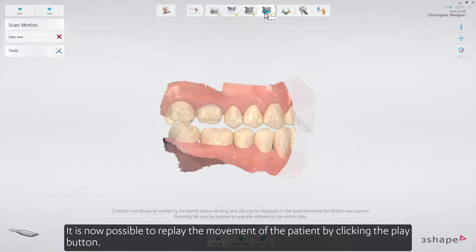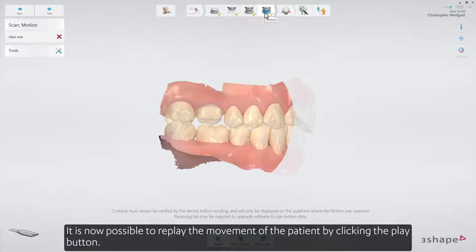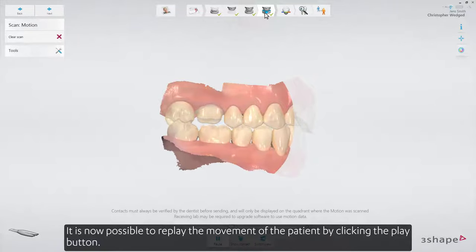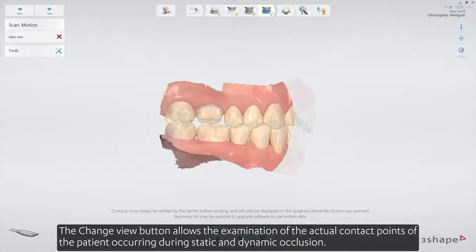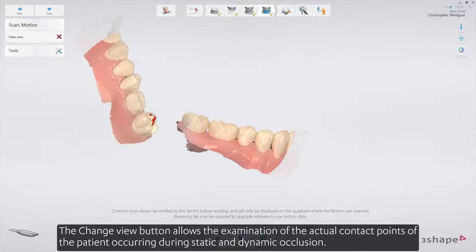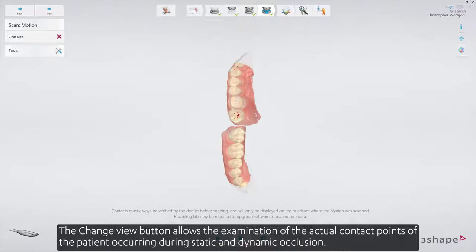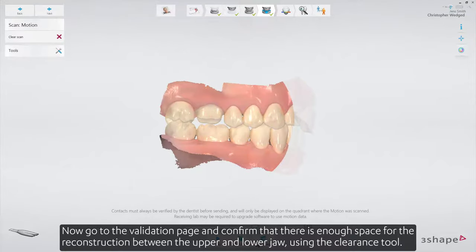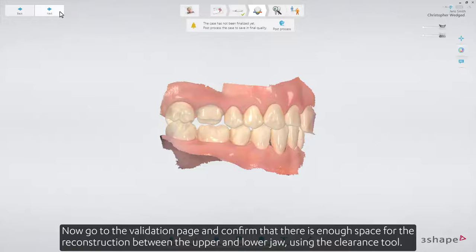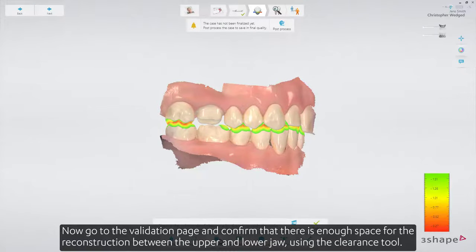It is now possible to replay the movement of the patient by clicking the play button. The change view button allows the examination of the actual contact points of the patient occurring during static and dynamic occlusion. Now go to the validation page and confirm that there is enough space for the reconstruction between the upper and lower jaw using the clearance tool.